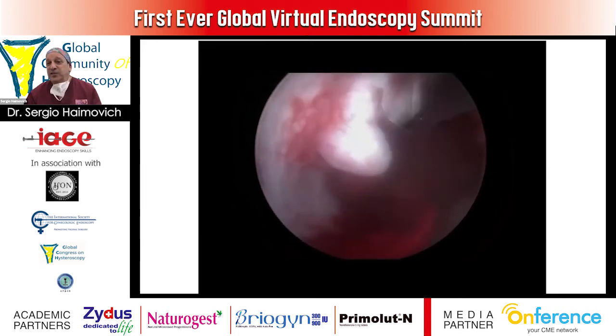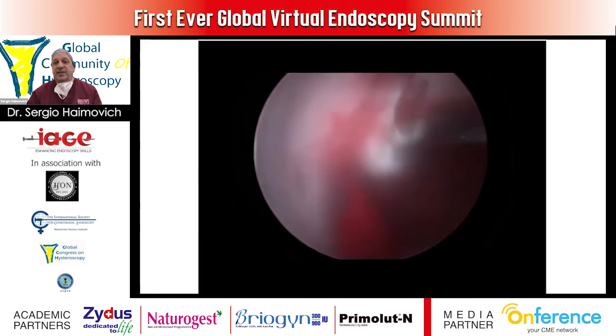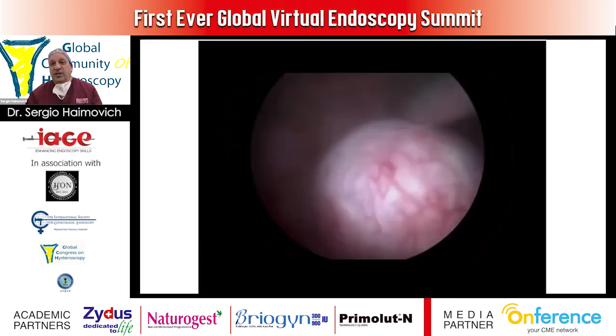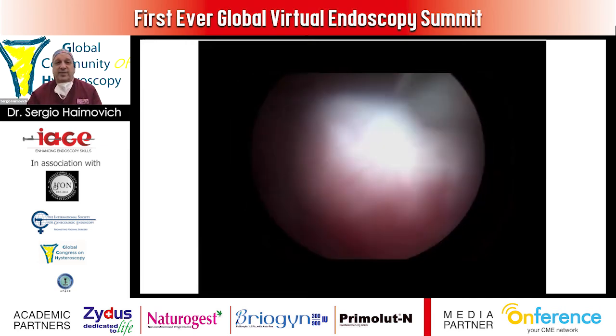It's very easy. You just put the myoma near the window of the tissue removal system, and the myoma slowly disappears into the system, and no more fibroid. This is another one, nice. You see again the removal.